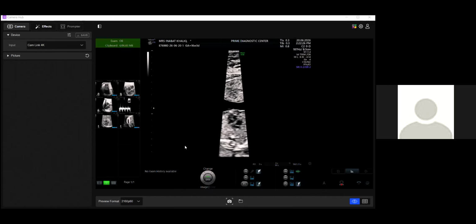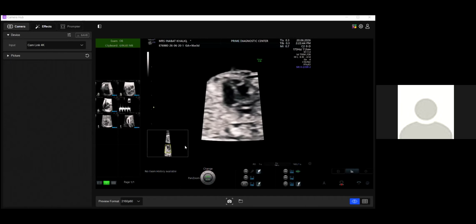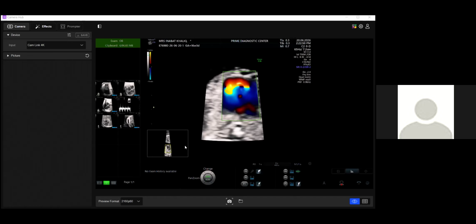So I now look at the frame rate. I've gone to a frame rate of 190. That is what was required for 16 weeks gestation. If the frame rate is high, it could actually reduce the resolution. Now I do it with the color Doppler, and muscular VSD is going to be a big challenge here.